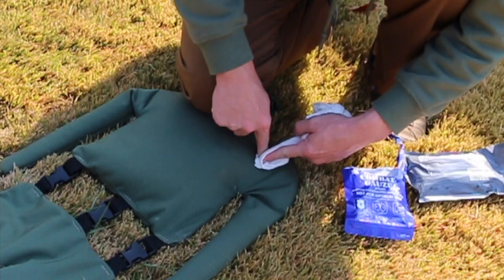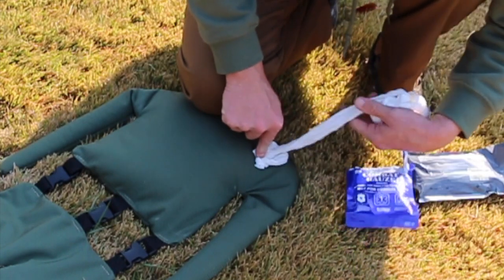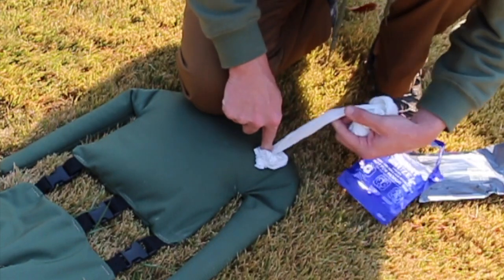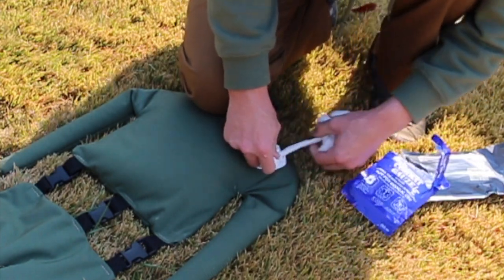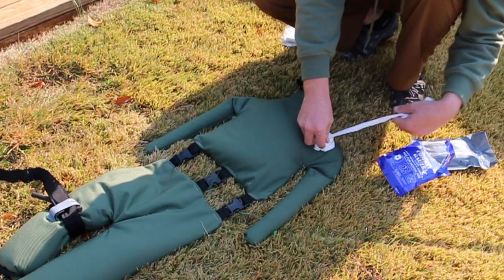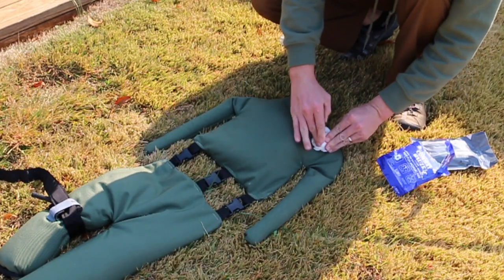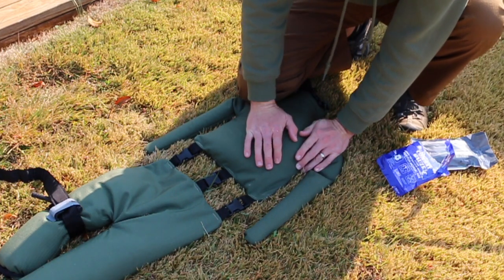Put this finger here, this finger comes in, goes right back on top of that source, and this goes in here, here, and here. So then, for sake of time, we wound pack this entire shoulder area here with the combat gauze. Get it all into the wound. We're going to hold pressure for about 3 to 5 minutes.